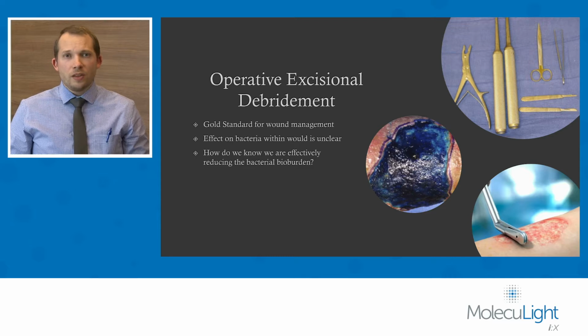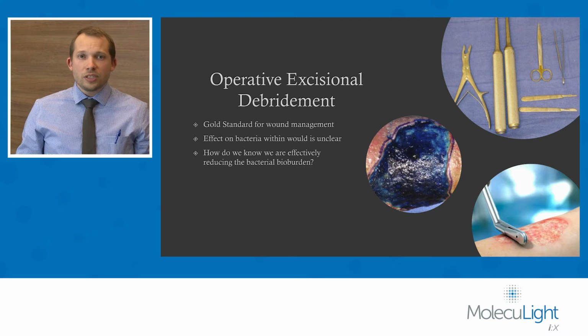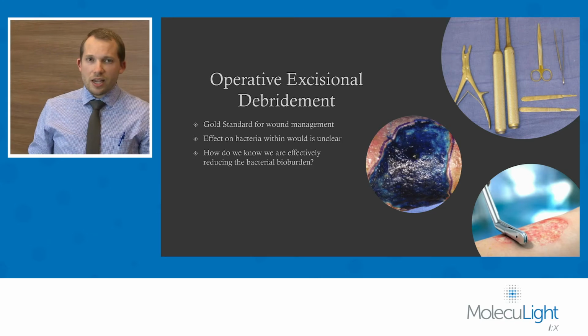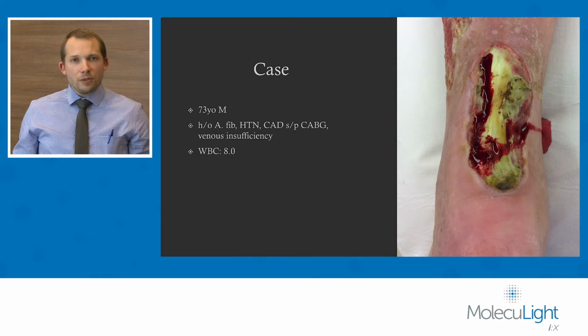Operative debridement is the gold standard for debriding wounds in a chronic wound patient. We typically use tools such as curettes, rongeurs, scalpels, etc. And one thing we don't understand is really how this operative debridement affects the bacteria within the wound. Now, let me start with a case.